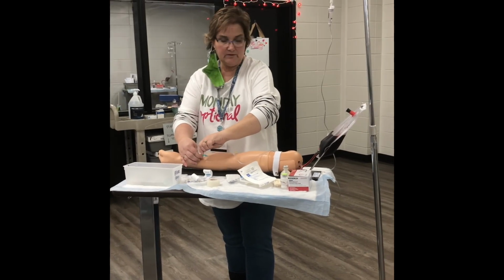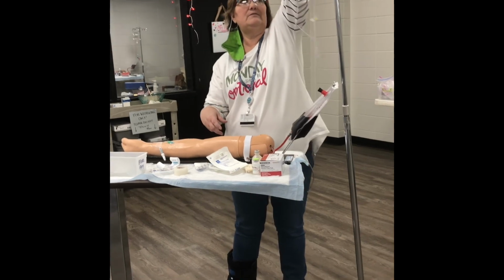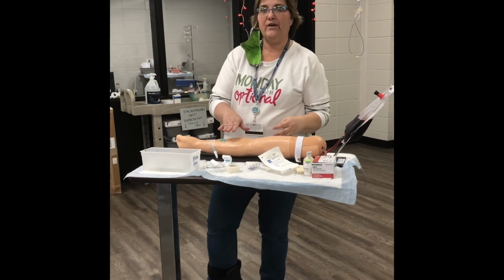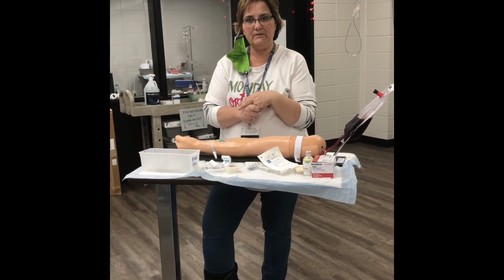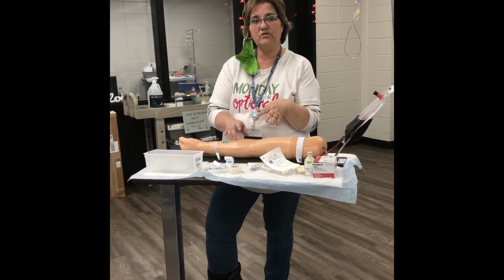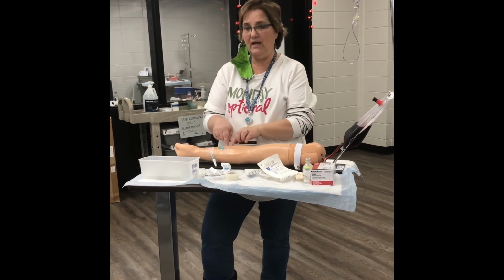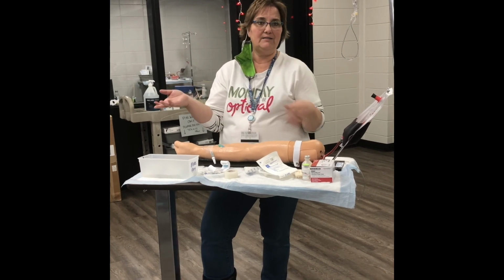Once your fluids are stopped, you're gonna undo your fluids from your arm. You're gonna assess your site. If it's cold and hard to the touch, what's probably happened? It's probably infiltrated, right? The IV's not any good anymore. If it's hot to the touch or red, it's probably infected. Either one of those scenarios, you can't use this site anymore, so just DC it, and you just start another site as an I&T line.